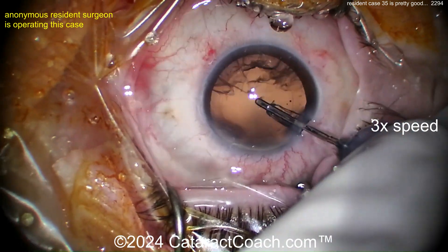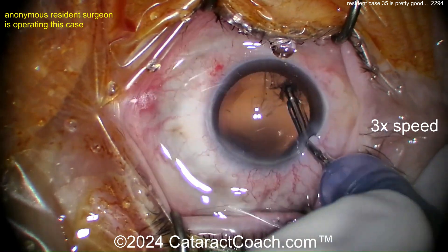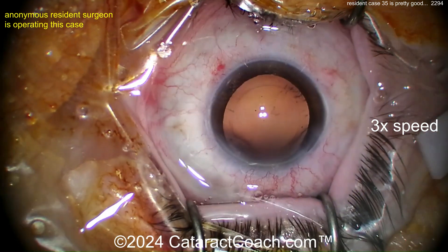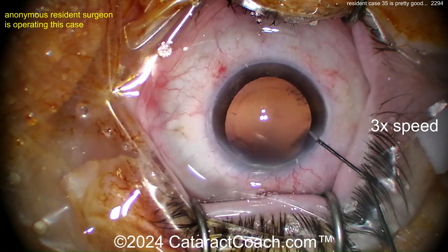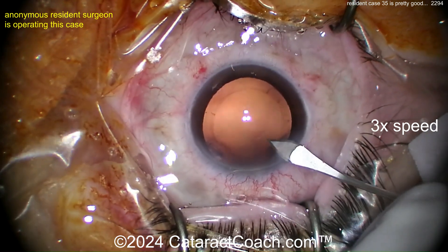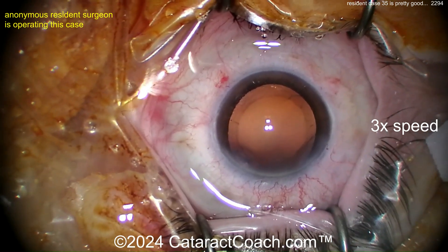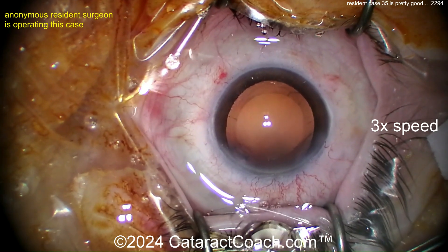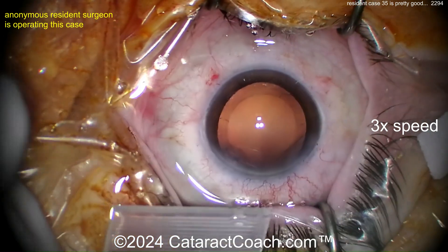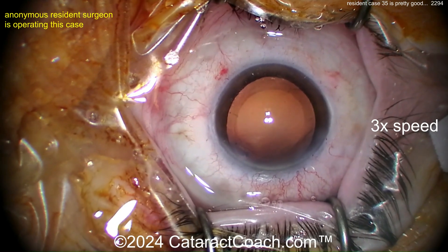Looks pretty good. I don't know about using two hands for the coaxial I/A probe — I don't think it's needed. You can use one hand; I don't see what the other hand does that benefits you. Maybe a little more stability, but that's just an artificial crutch. Eye is still in primary, which is pretty good. You're filling the capsular bag with viscoelastic. Now let's see the lens going in — enlarging the incision a little bit. You want to fixate the eye when you enlarge that incision. I'd like to see young doctors and residents loading their own lenses so they understand that process.